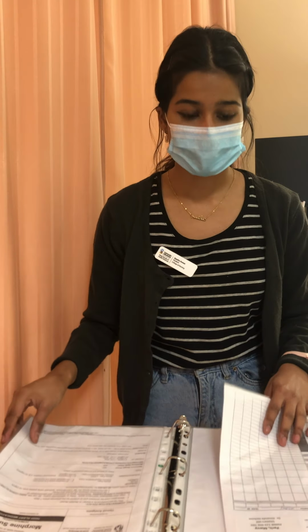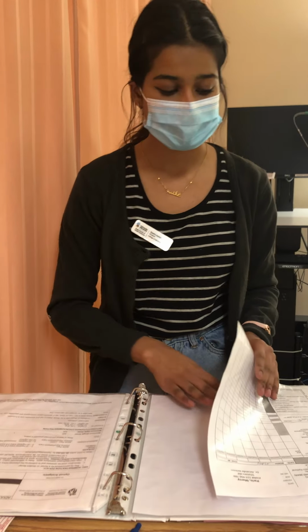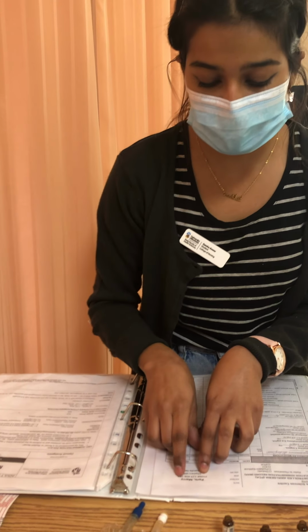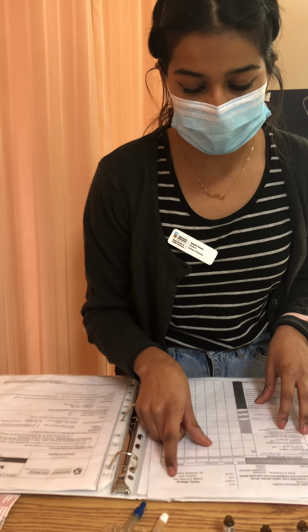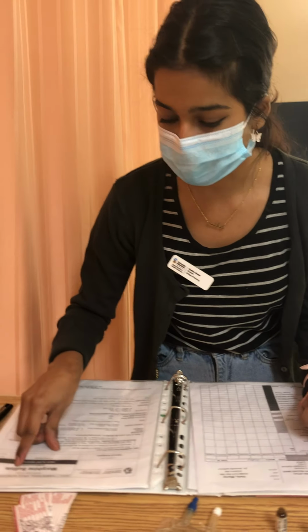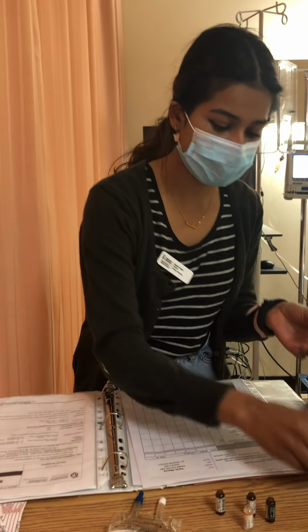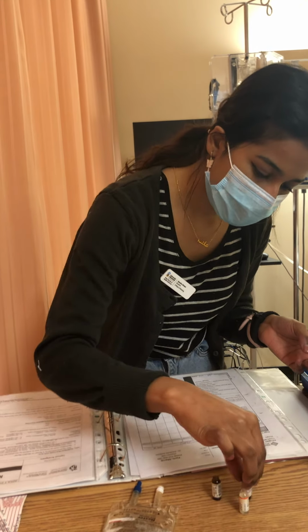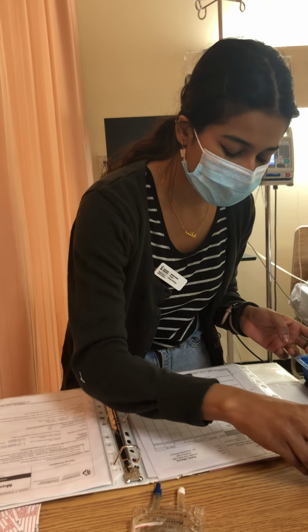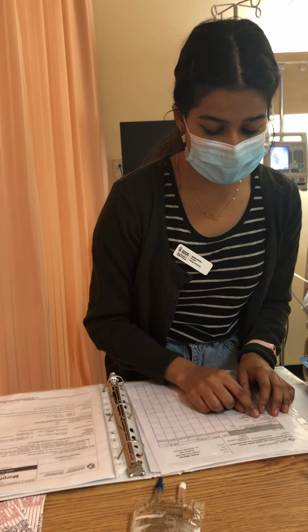Now I'm going to do my first check with my MAR, my PDM, and my vials. So we have the right patient, Marcy Paris, FIN 1, 2, 3, 4, 5, 6, 7, 8, 9. Right medication, morphine, and we have a PDM for morphine sulfate. We have the right drug. Right dose is 1 milligram.